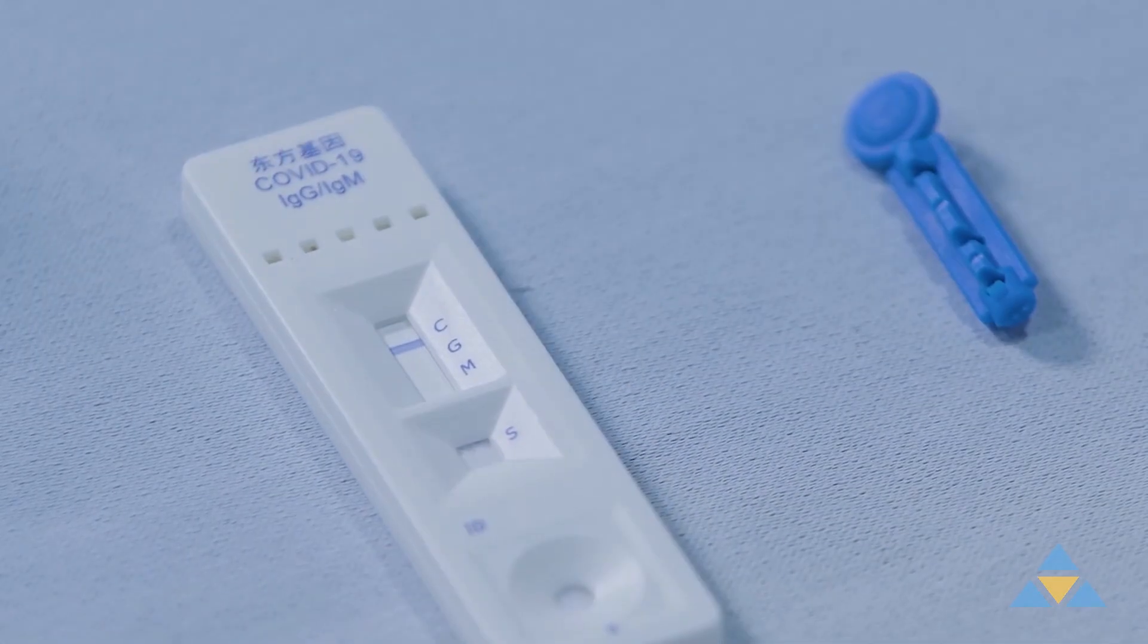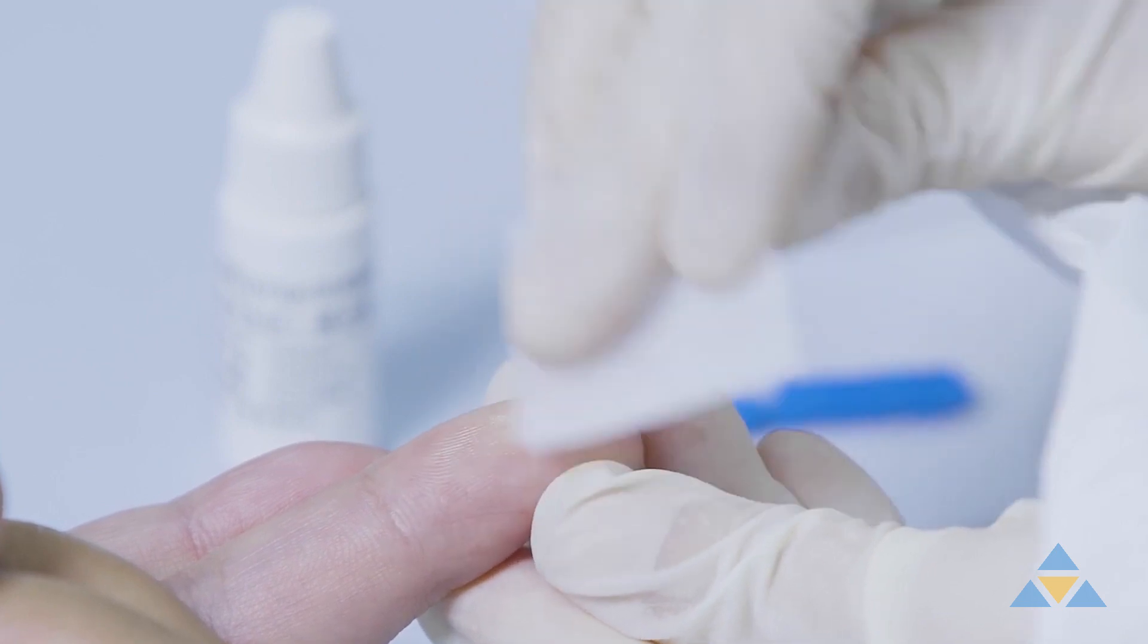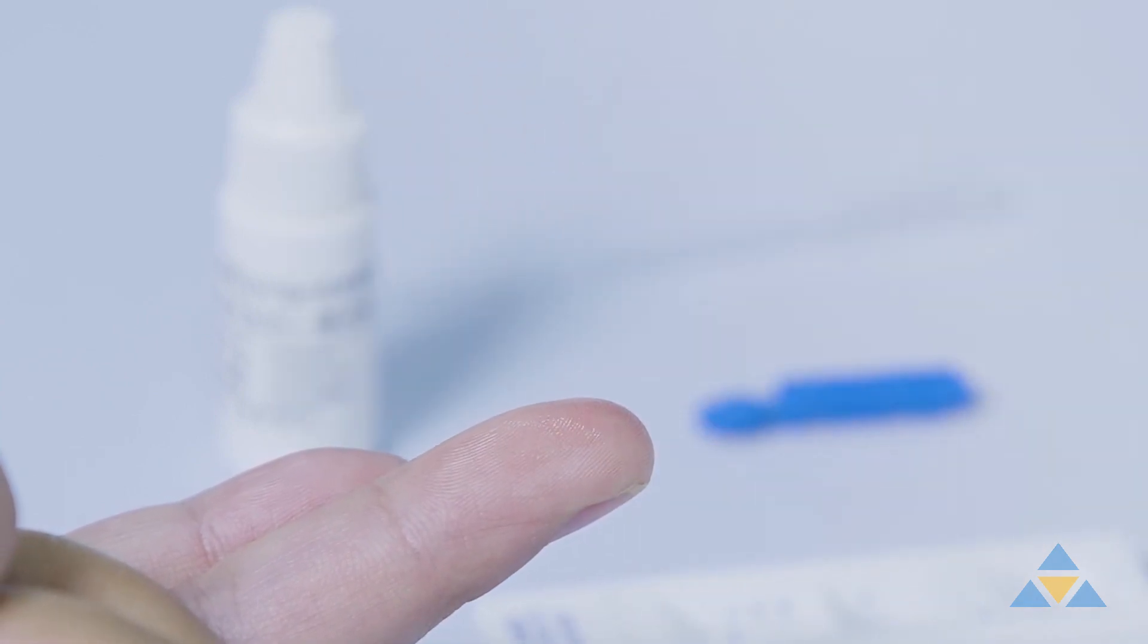Tear open the foil pouch and place the test cassette on a clean and level surface. Wipe and disinfect your fingertip with an alcohol pad before taking a blood sample.